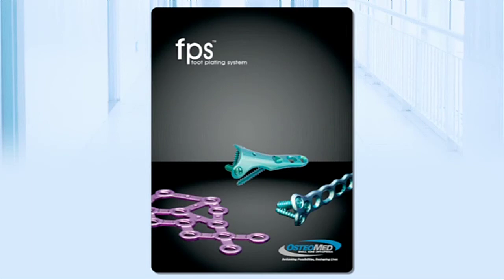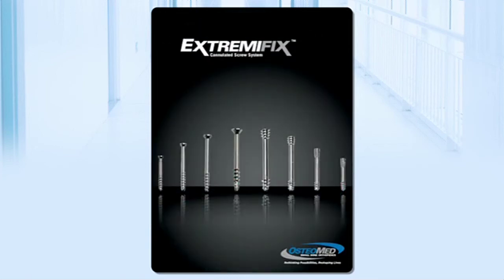The FPS foot plating system features the latest in variable angled locking technology to treat multiple reconstructive and trauma applications. And finally, the ExtremaFix cannulated screw system offers a wide variety of cannulated screws in headless and cannulated lag options to treat multiple indications.